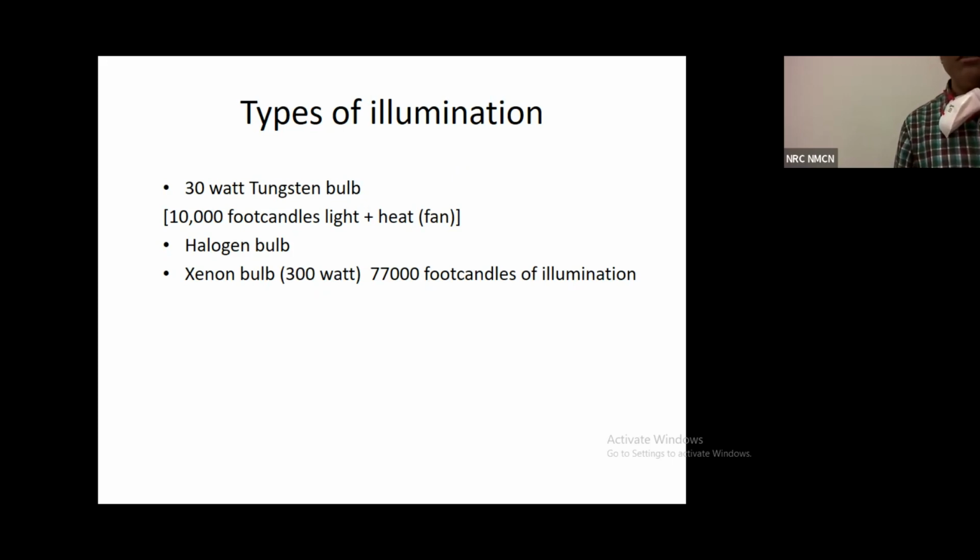That is why there are all these mechanisms. Like the Leica microscope has a patented technology known as the bright eye care. Basically, it is nothing but when you zoom in, the intensity of light will reduce, or when you take the microscope closer to the operating area, then the intensity of the microscope light will automatically reduce by itself. And this is present in almost all the good brands of microscopes.